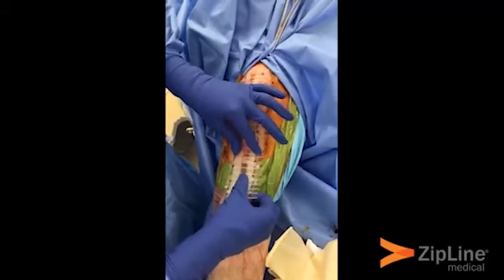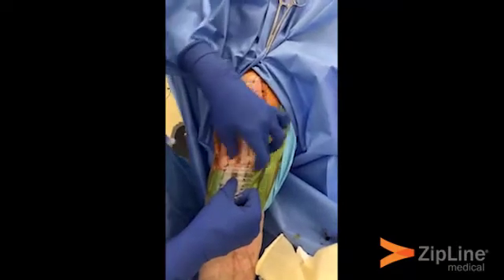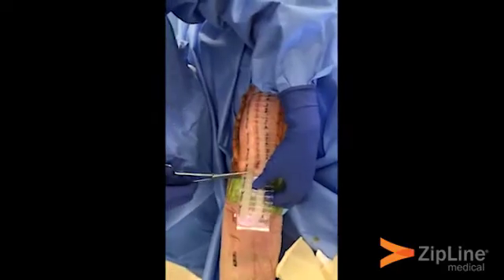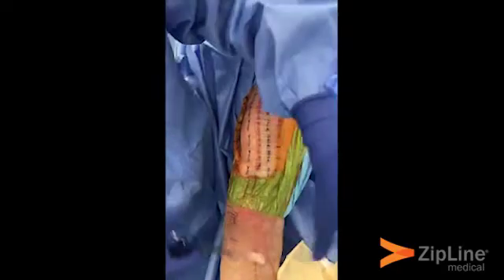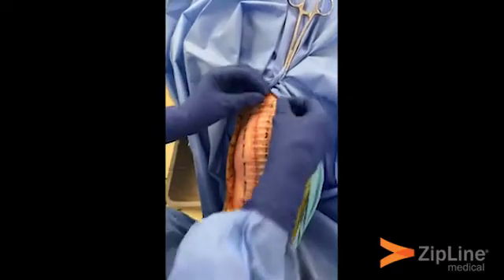Run it all the way down until there's one zip tie distal to the most distal portion of the incision, and then cut the Zipline to size.